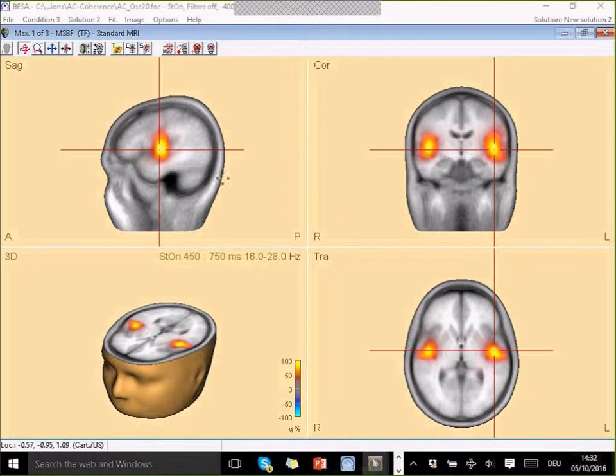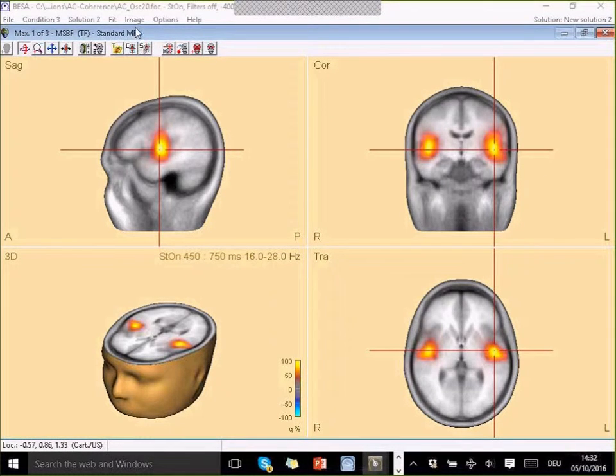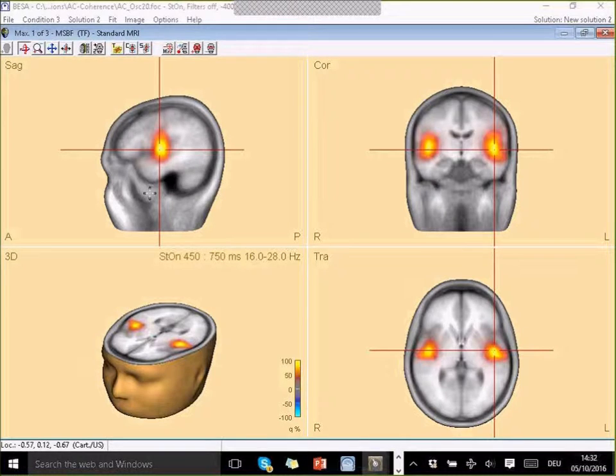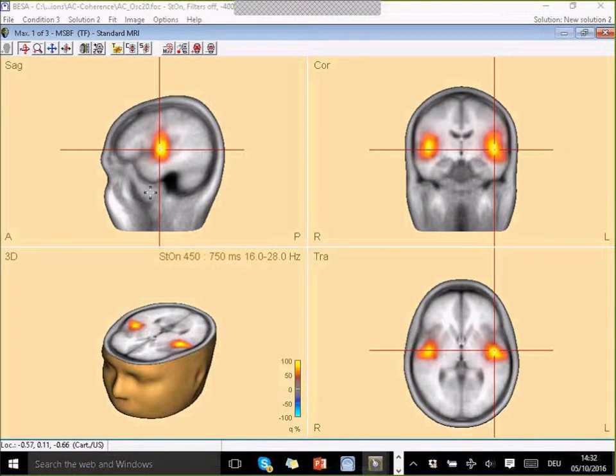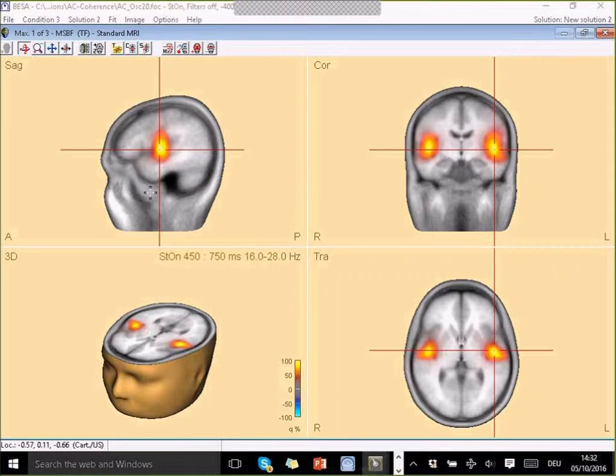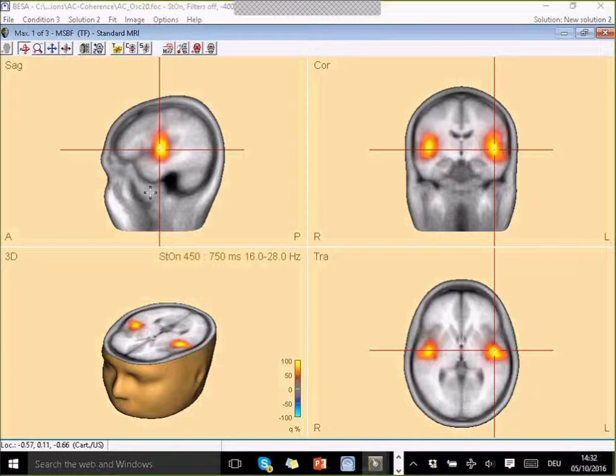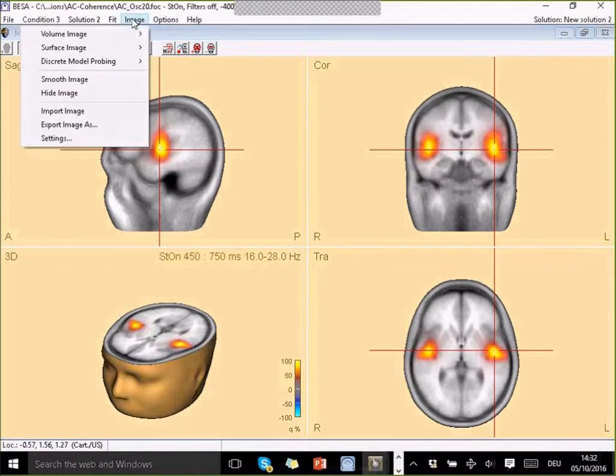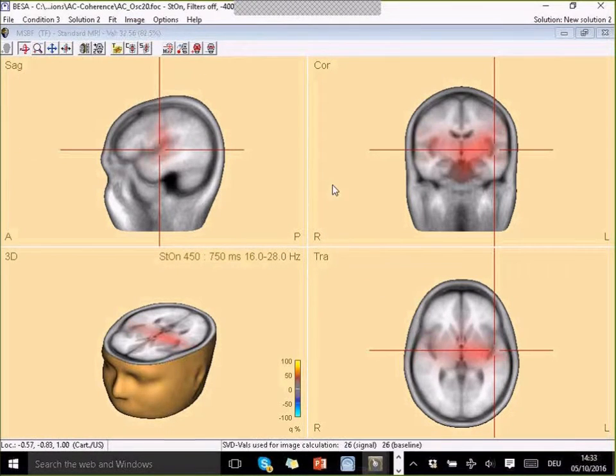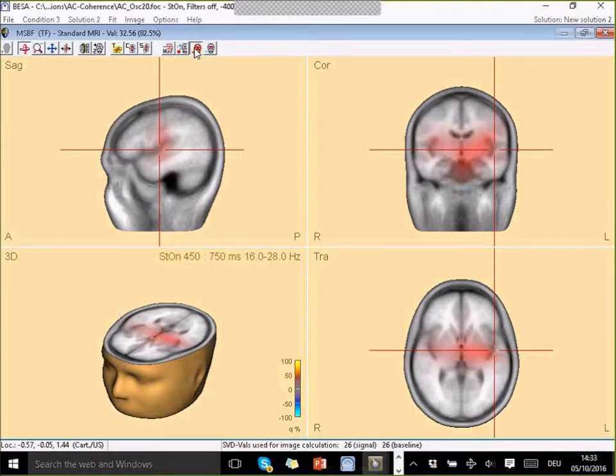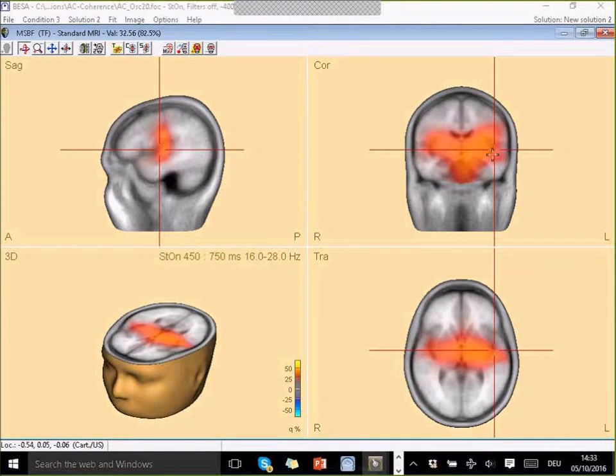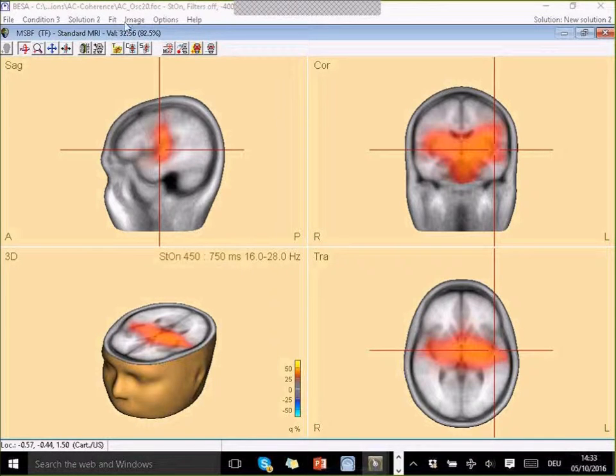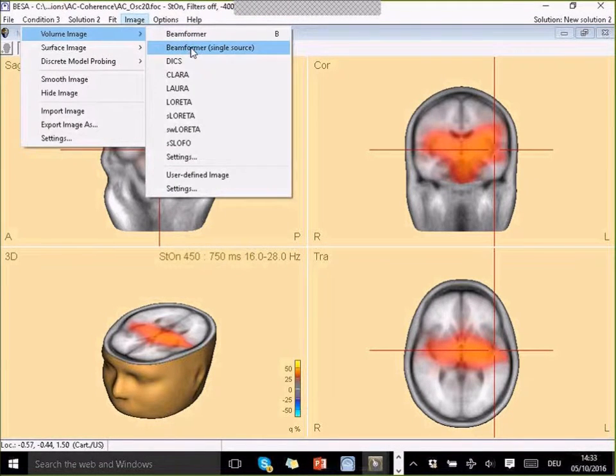Now it will compute the cross-spectral density across this and then show me the beam former result and automatically jump to the highest maximum. This is the so-called multiple source beam former. That means that it automatically chooses bilateral positions for my voxels that are evaluated during the beam forming computation. This should be preferable if I'm looking for potential bilateral activation. We also have a single source beam former which I can show you too. Single source beam former looks like this. It has a much more spread activation over the two hemispheres than the multiple source beam former.